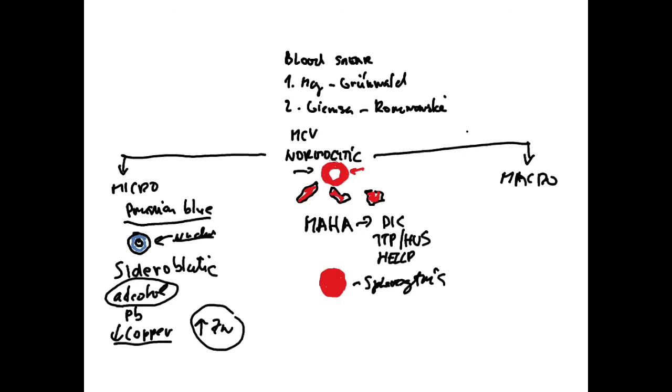And then with normocytic, remember, this was schistocytes, this was spherocyte over here. Still we got the G6PD deficiency, and remember those are the bite cells. So bite cells look like this. See, they're bitten over here. That's very typical, bite cells. You will see them with normal staining, but with a special staining, not with the Pappenheim staining, or with the other ones than these.